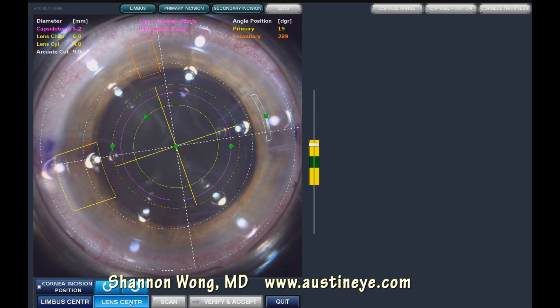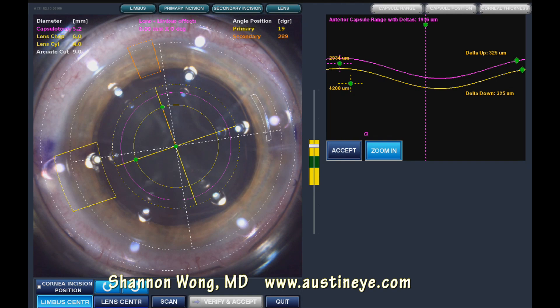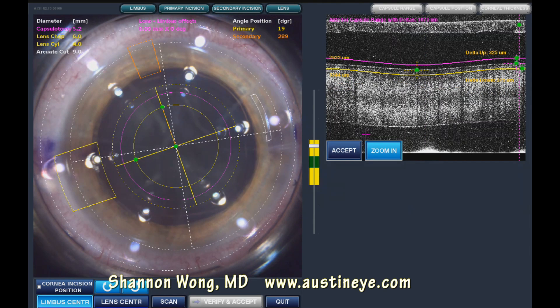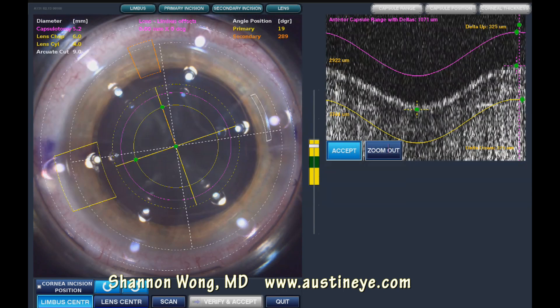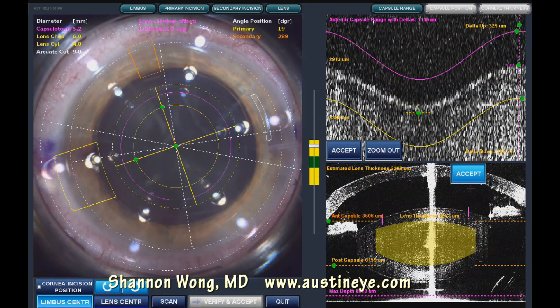Now that we've got good positioning of all our corneal incisions, we center our capsulotomy incision on the pupil. We then activate our OCT, and the top right image shows the anterior capsule and posterior capsule in the lens. We get a zoomed-in version of the anterior capsule image, which helps us to account for any lens tilt.